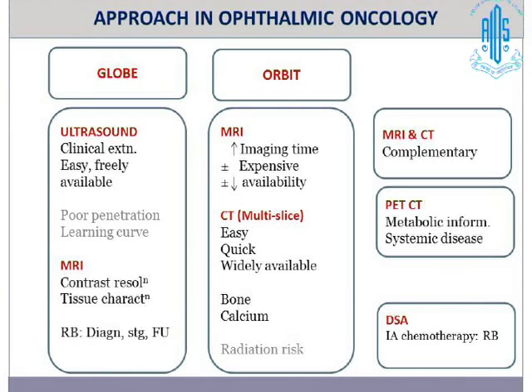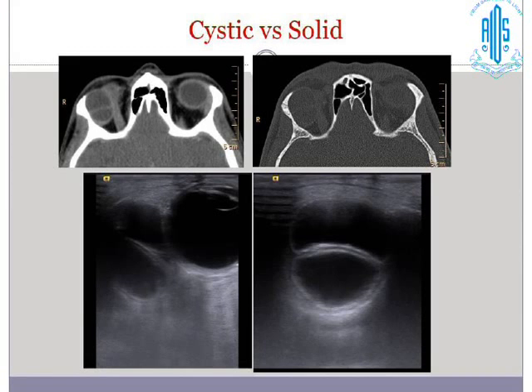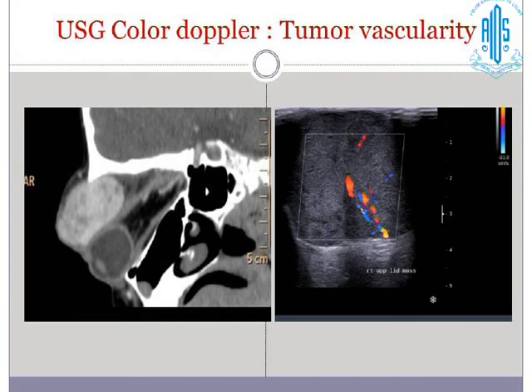Now, I'll describe a few examples. This is just to show a strength of ultrasound, which shows a cystic lesion behind the globe so much better than CT does. So, advantage ultrasound. Now, this is just to show that the parasagittal image in a lid tumor will tell you how far behind the orbital margin a tumor would go. An excellent assessment, preoperative information for a surgeon.